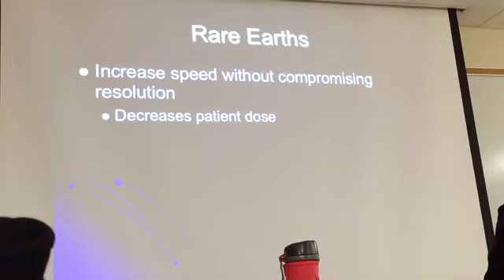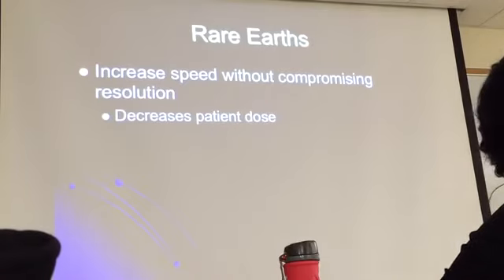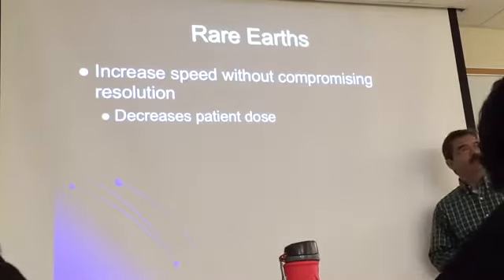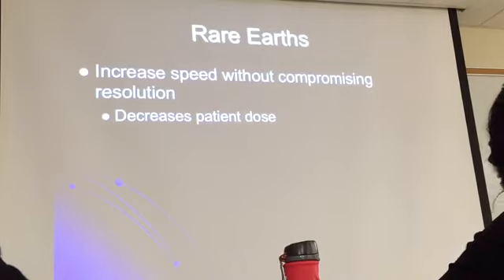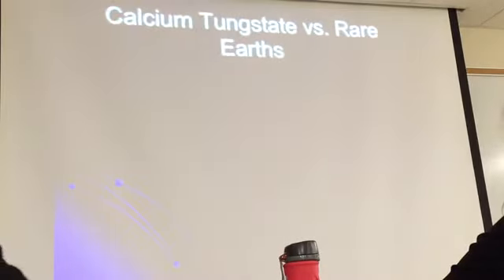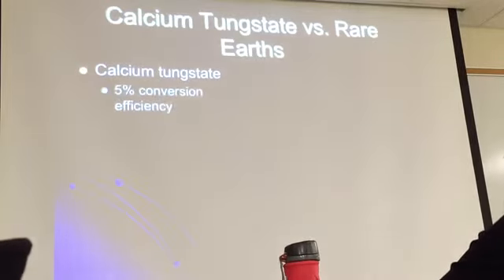All right, in general, what you have with intensifying screens, specifically with rare earth screens, is a decrease in patient dose. That's the most important thing, decrease in patient dose. All right, so let's take a look. Let's compare calcium tungstate versus the rare earth, just to give you a hint of what's going on here.